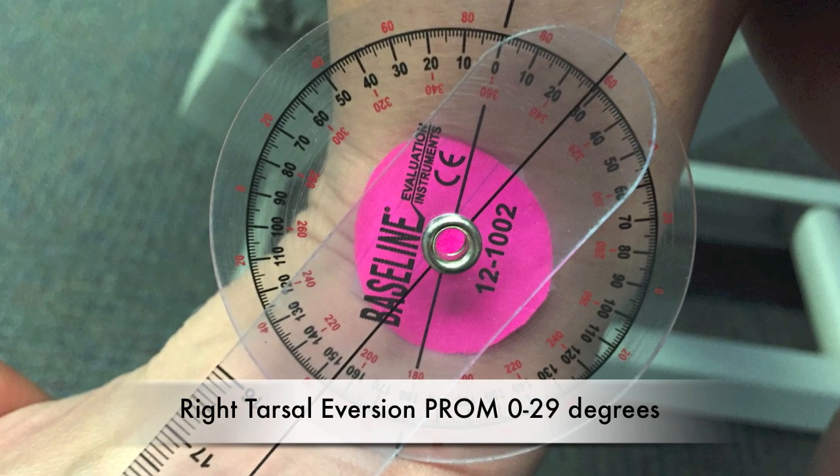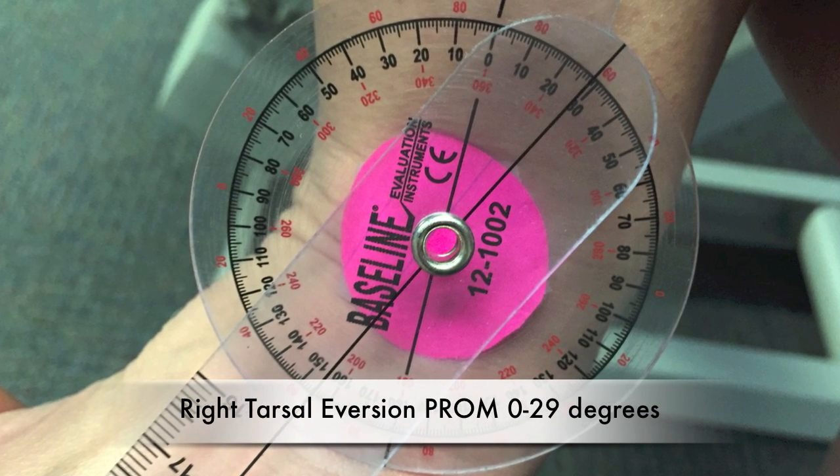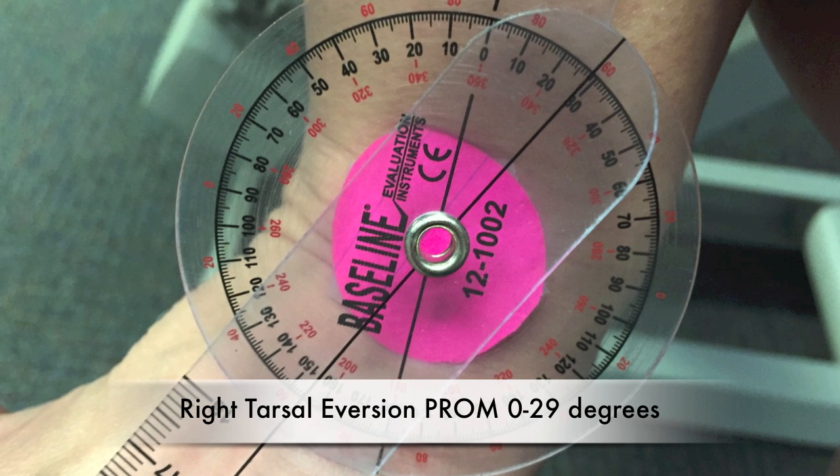Right tarsal eversion passive range of motion: 0 to 29 degrees.